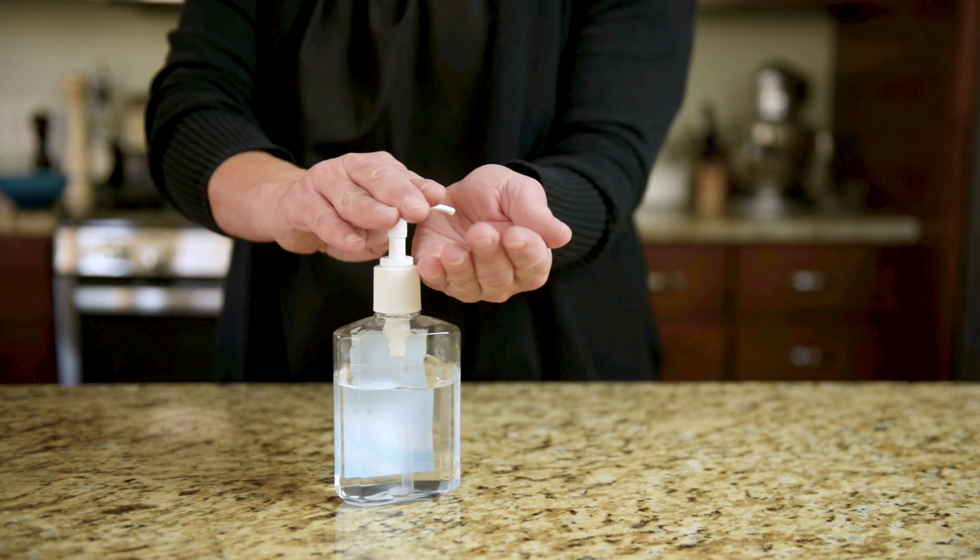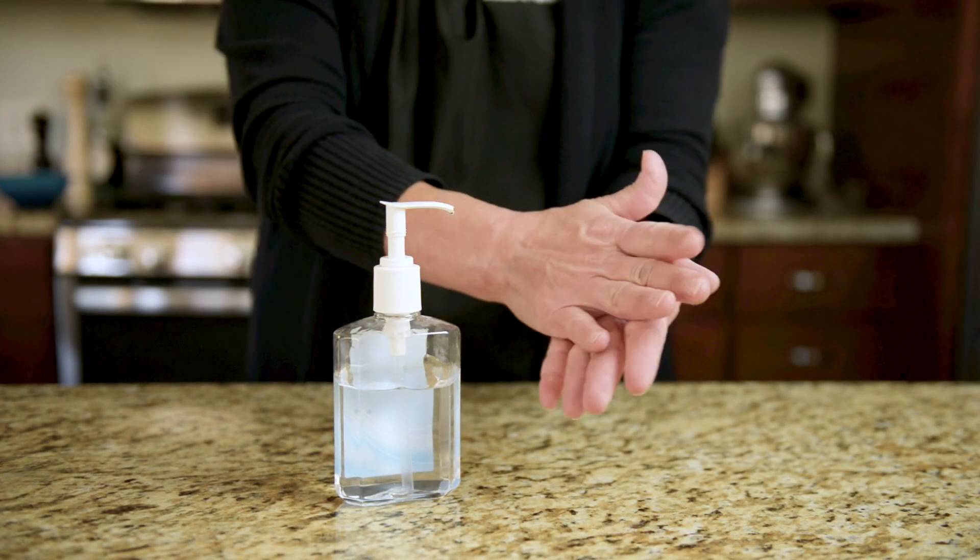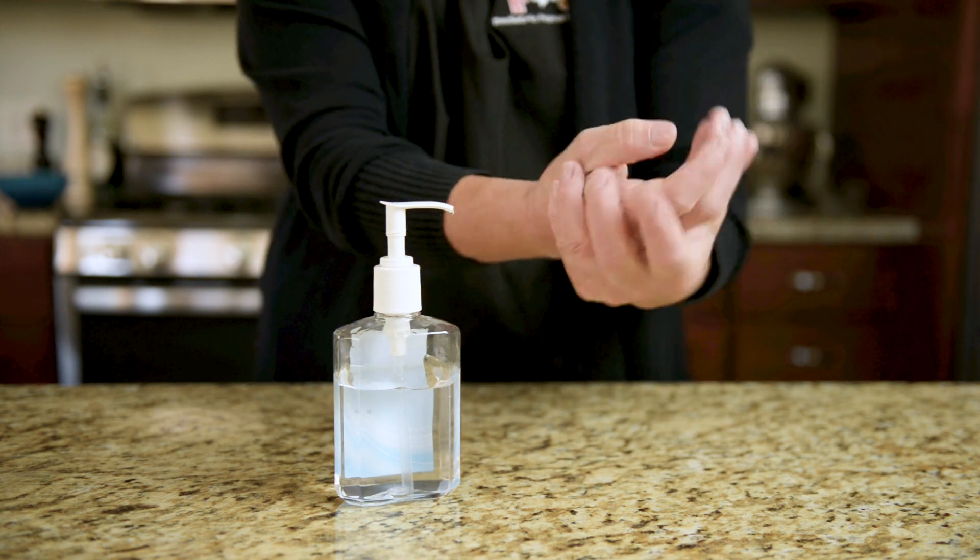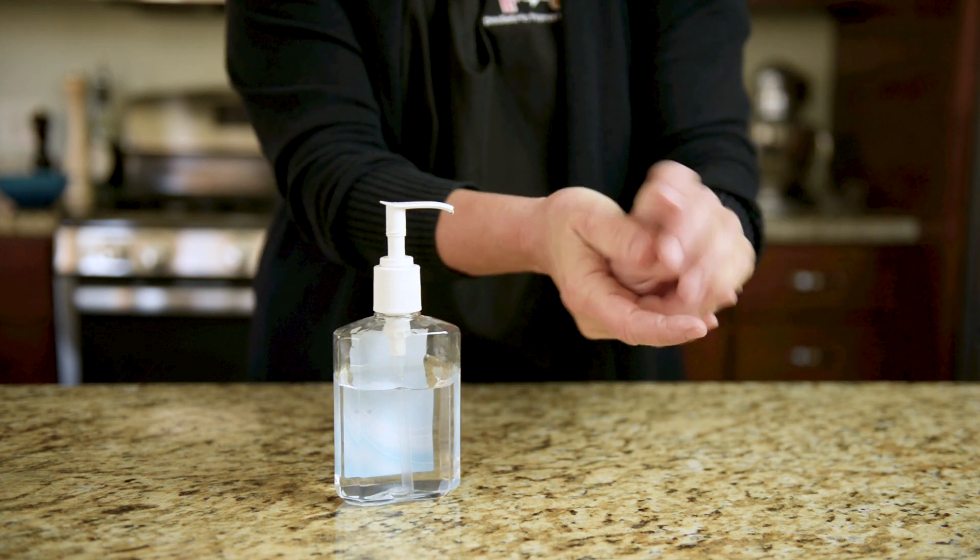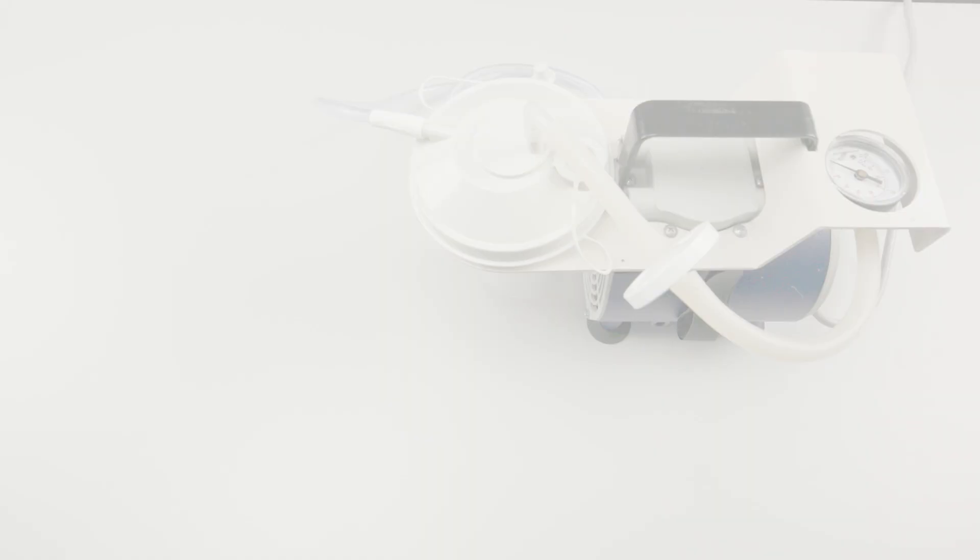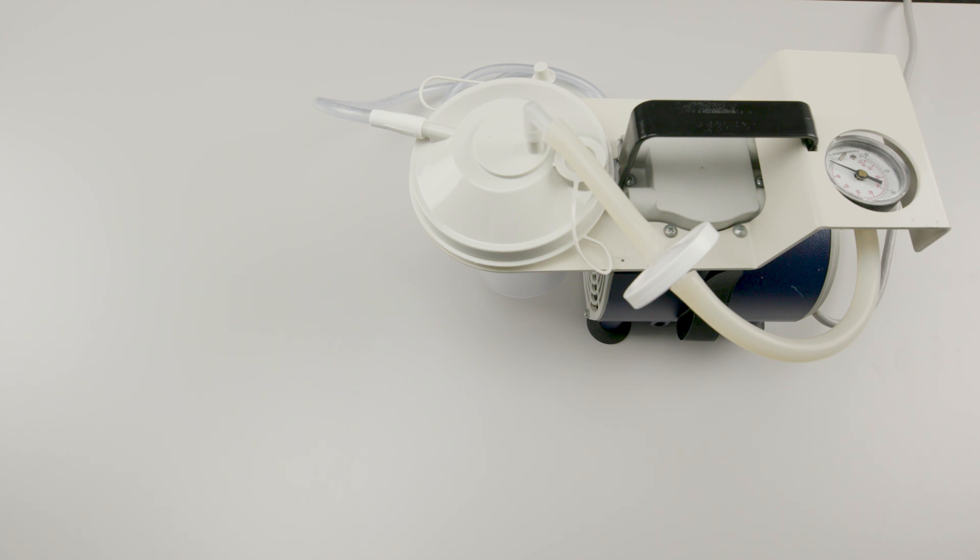Start by cleaning your hands with soap and water or alcohol-based hand gel. Clean your work surface with soap and water or a disinfecting wipe. Gather the equipment and supplies you need.